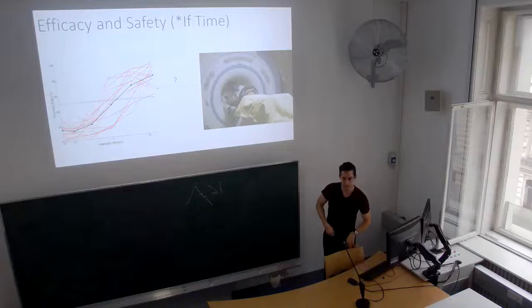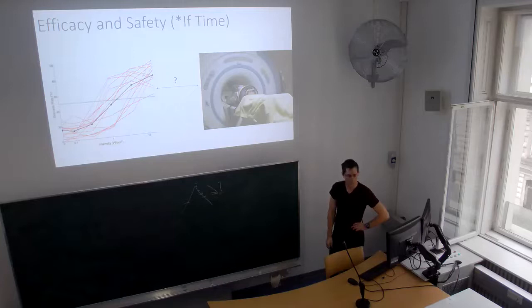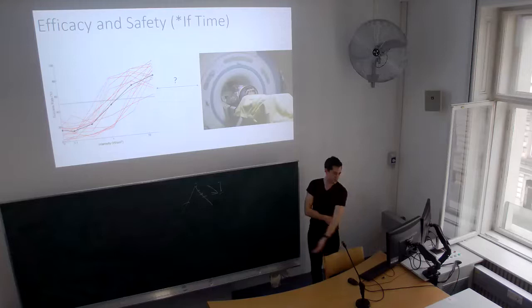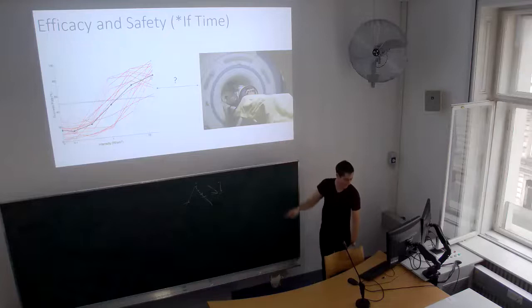Okay, so this is the final section, everyone. Almost done. But this is what I'm talking about: safety. We kind of know what the threshold intensity is to obtain neuromodulation from stuff like this. We're crossing a certain threshold where most of the time we're getting a tail kick at this intensity. So we kind of know the lower limit to what is effective, but it's pretty unclear what the upper limit is to safety. So we want to be in that range. We want to be definitely effective, but we don't want to ablate the brain, obviously. We want to be pretty far away from what's used surgically. So what do we know about that?